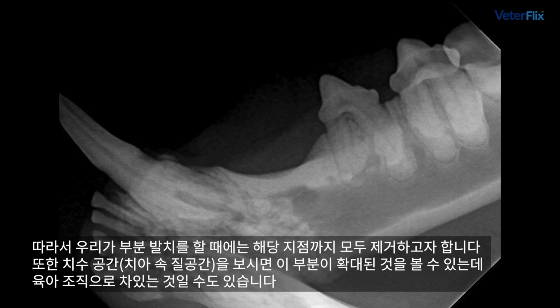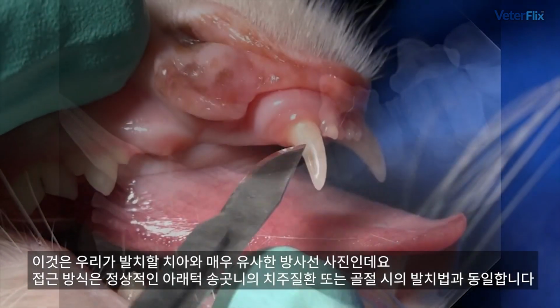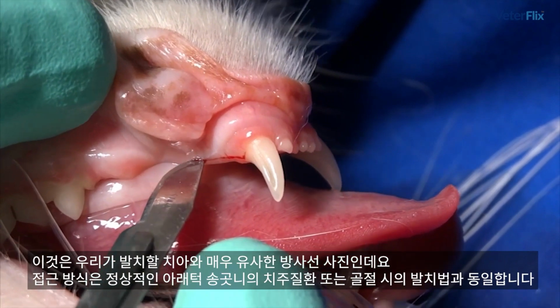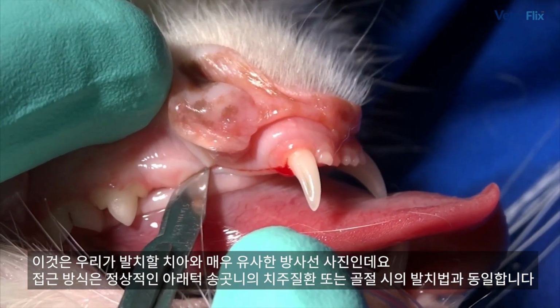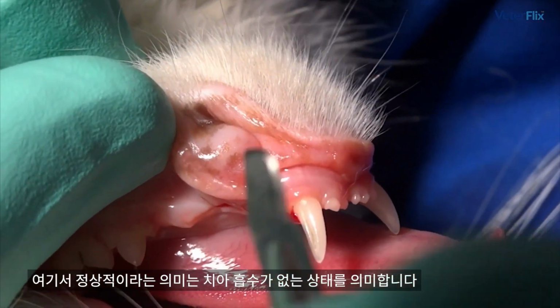And if you look at that area in the pulp cavity that's enlarged, that could be granulation tissue inside of that. So this is a very similar radiograph to the tooth that we are going to be extracting here. And the approach is exactly the same as we would take to extract a normal mandibular canine tooth that's been affected by periodontal disease or fracture. It being normal meaning not tooth resorption.